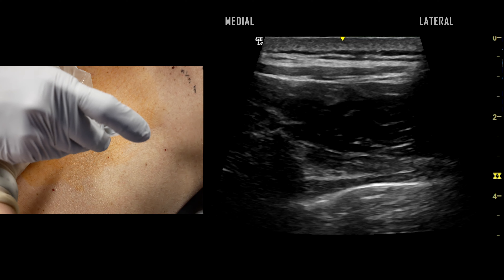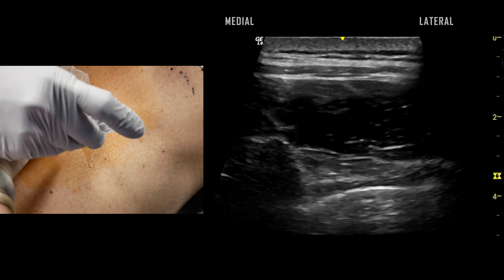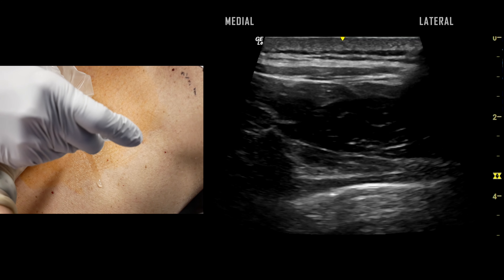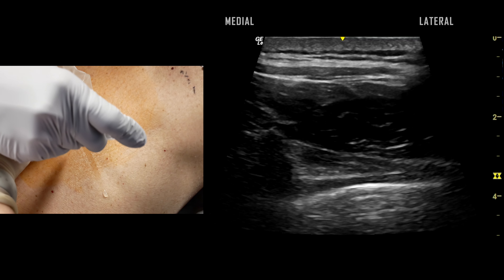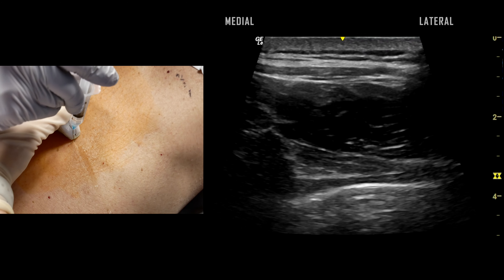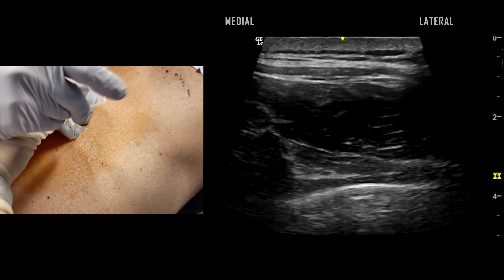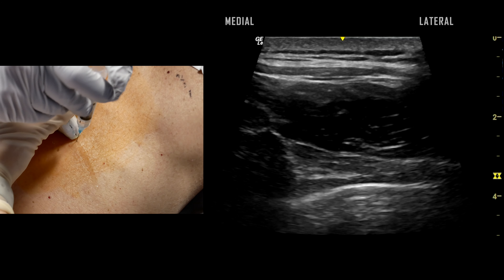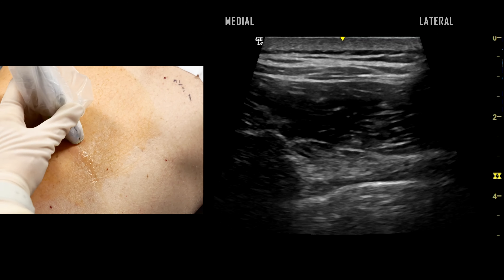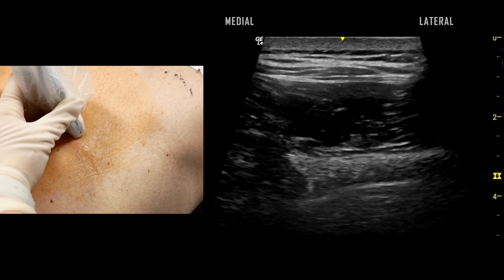Approximately 3 to 5 milliliters of lidocaine is administered subcutaneously prior to insertion of the block needle. As observed here, the trajectory of the block needle may be approximated with the local needle.